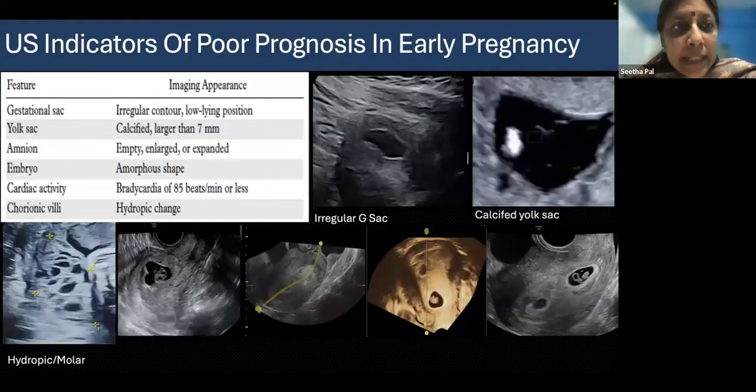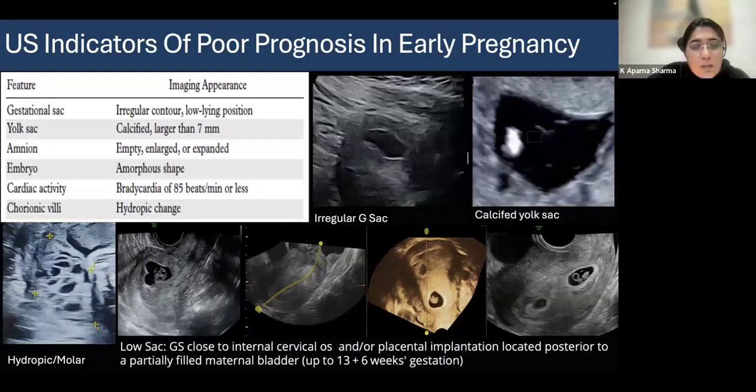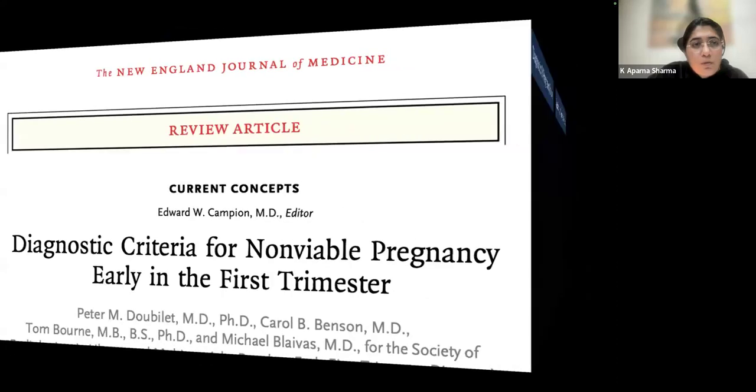So that would be there. Yes, bradycardia to some extent, even at around 10 weeks, if it is still less than 110, we would consider all of these as telltale signs. And yes, we need to follow them up, not make the patient anxious, and give them the benefit of the doubt. So thank you for putting all of that together.